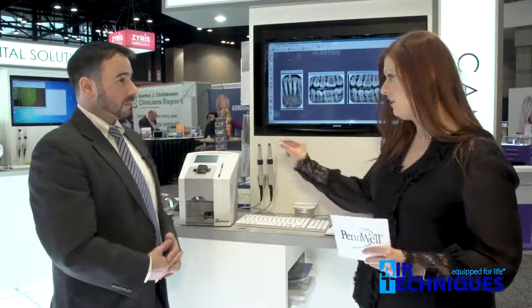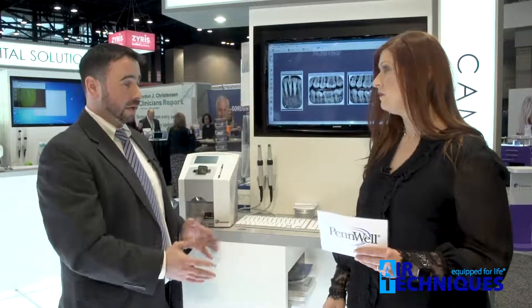I particularly like that the sensors are really thin and really small, and I think it's going to offer a lot of comfort for the patients. Exactly, and that's one of the unique selling points of a phosphor storage plate solution like ScanX. They're thin, they're flexible, you can place them in any patient's mouth. And because they're available in all sizes, zero through four, you'll get 100% of your imaging needs, 100% of your time.